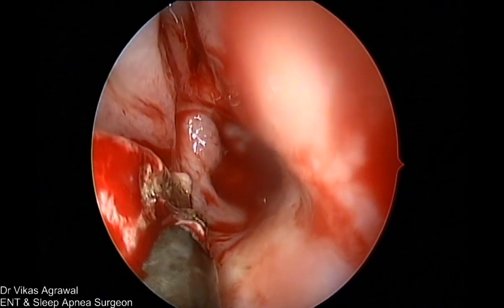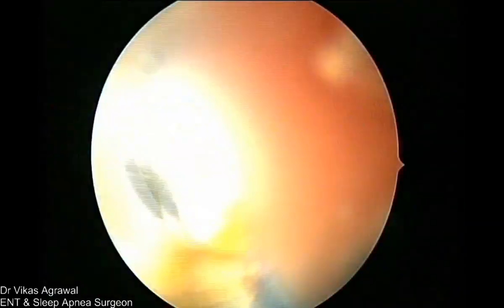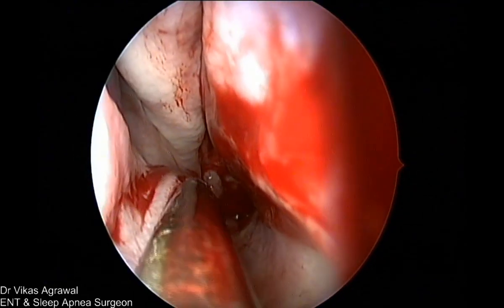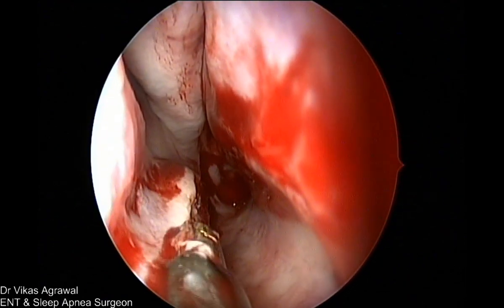So this I am just cauterizing. Superficial cautery to stop that ooze should be enough. I have not exposed any vessel. Now this mucosa is supposed to be lost. The mucosa of the upper part of the inferior turbinate is important. The lower part is polypoidal.